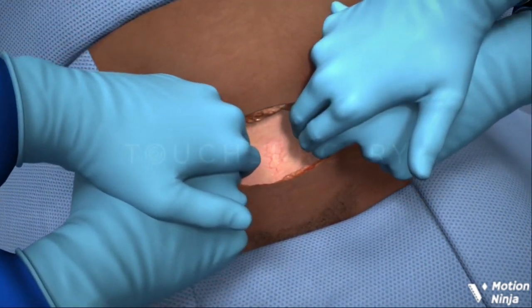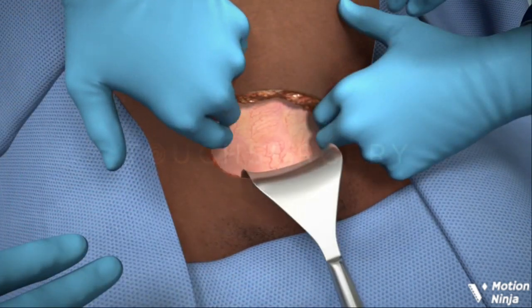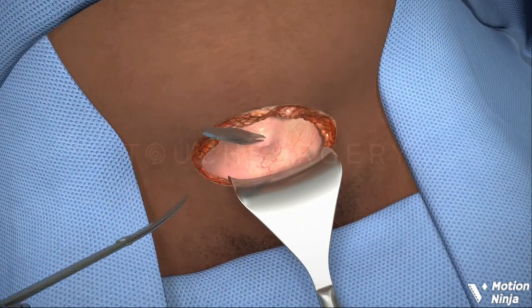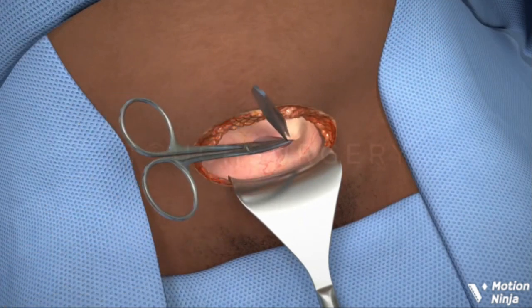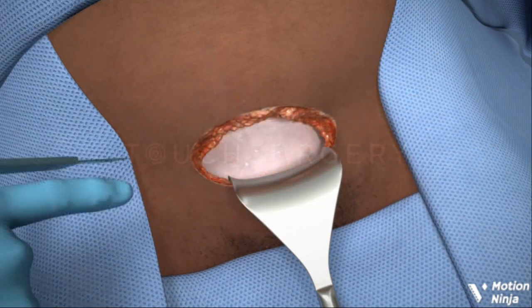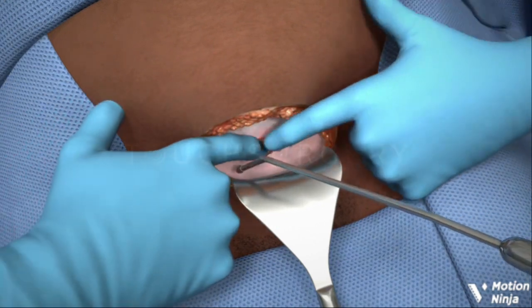A retractor is placed in the inferior aspect of the incision to hold the bladder out of the way and to protect it. The surgeon will then cut an incision into the lower segment of the uterus.